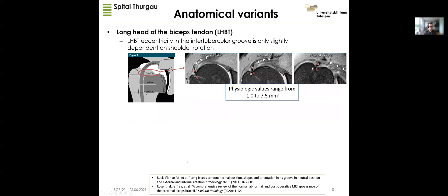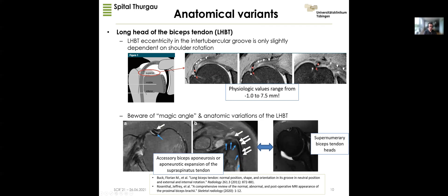When we talk about the biceps pulley, we also have to mention the structure supported by it — namely the long head of the biceps tendon. An interesting study showed that if you put the humeral head in neutral, external, or internal rotation you have a significant influence on the position of the LHBT in the supraglenoid part of the joint, but these changes are rather small — only 1 to 1.5 millimeters — compared to the physiologic range of LHBT positioning relative to the deepest part of the bicipital groove. Be also aware of the magic angle artifact, which manifests as an unwanted increase in signal of tendon and fibrocartilaginous elements placed at 55 degrees relative to the B0 field, especially with low echo time sequences below 34 milliseconds.